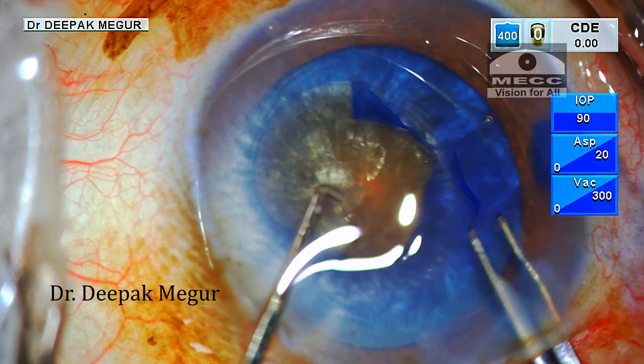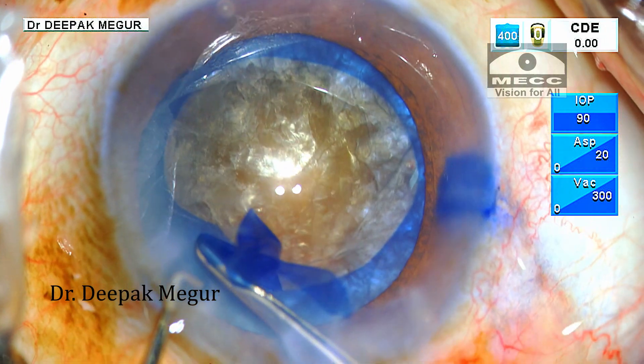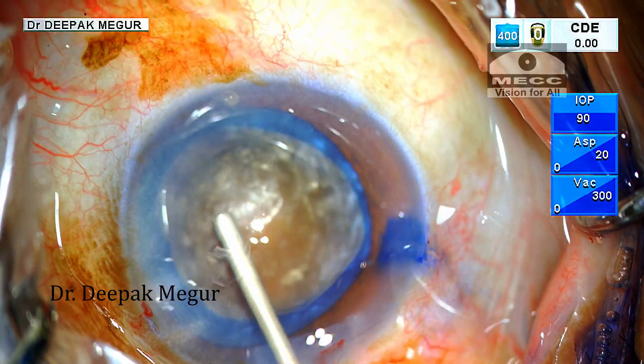Now the underlying nucleus shows its true colors. This brown bulky nucleus was hiding behind the soft fluffy white cortex. A slightly bigger rhexis is beneficial when dealing with these bulky hard lenses.